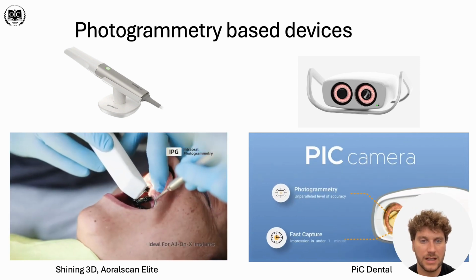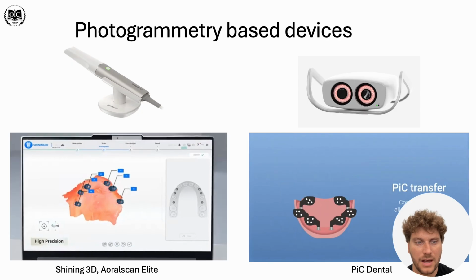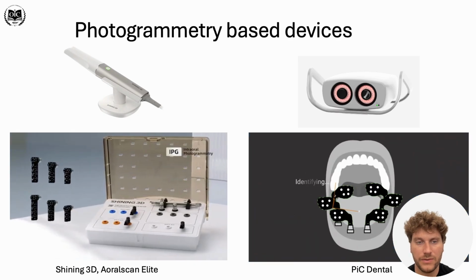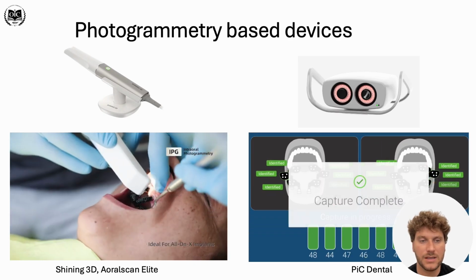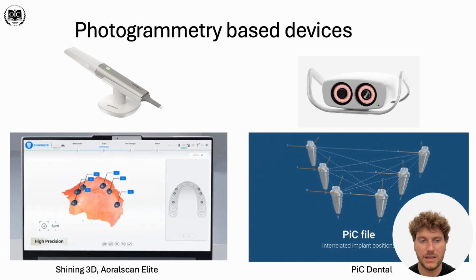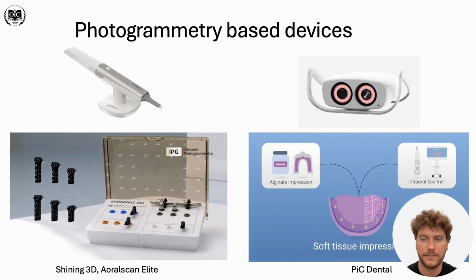But recently, some intraoral scanner companies introduced scanners that have hardware and software algorithms to deal with full arch implant cases, with promising results. But yes, as with all new things, we need some research, and we need to have some proof behind these concepts.